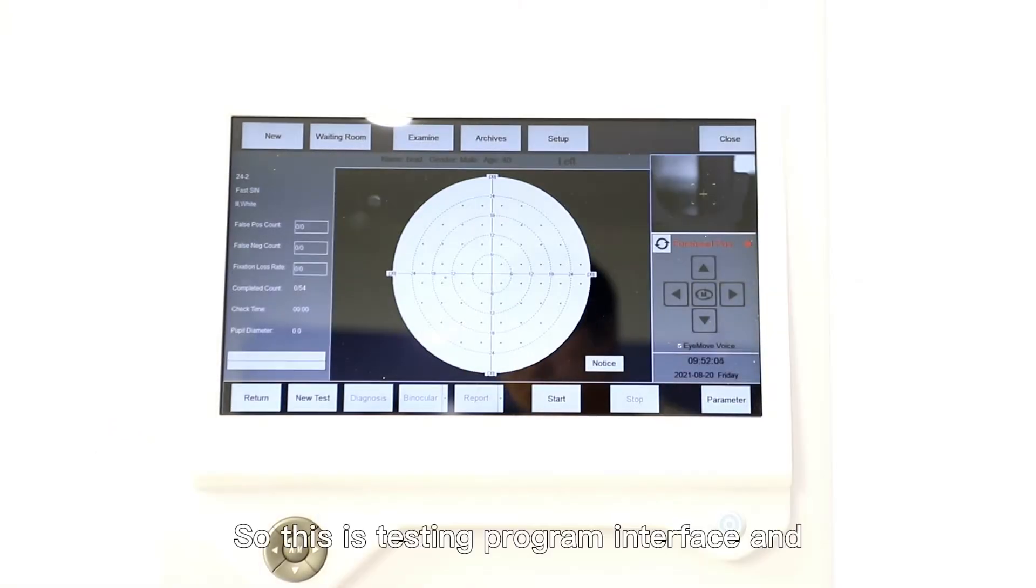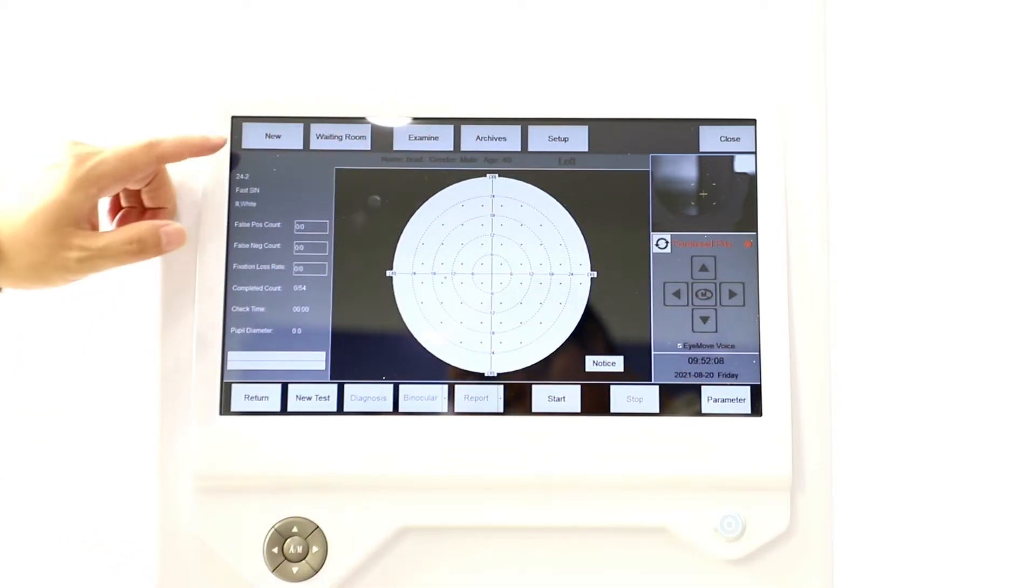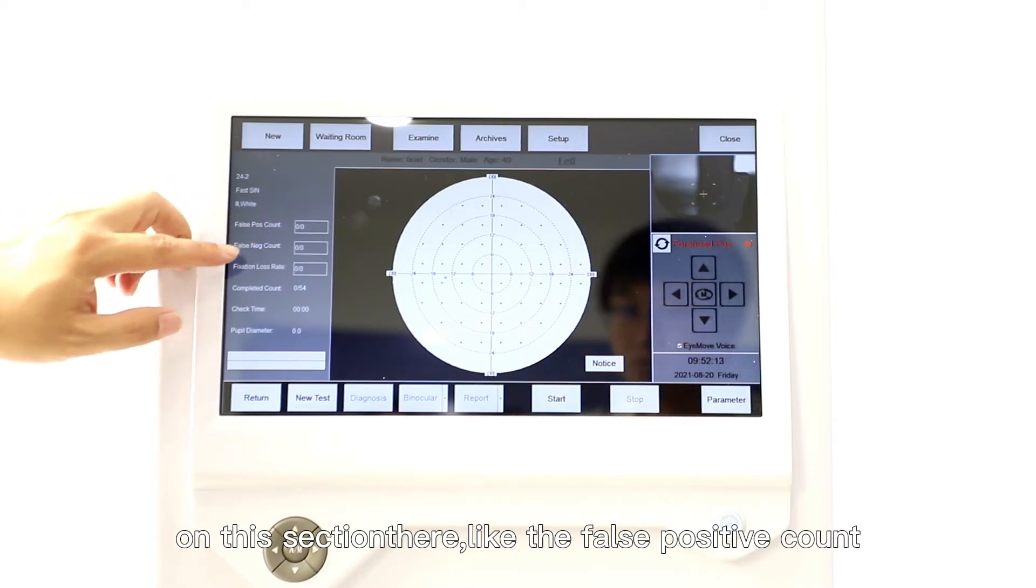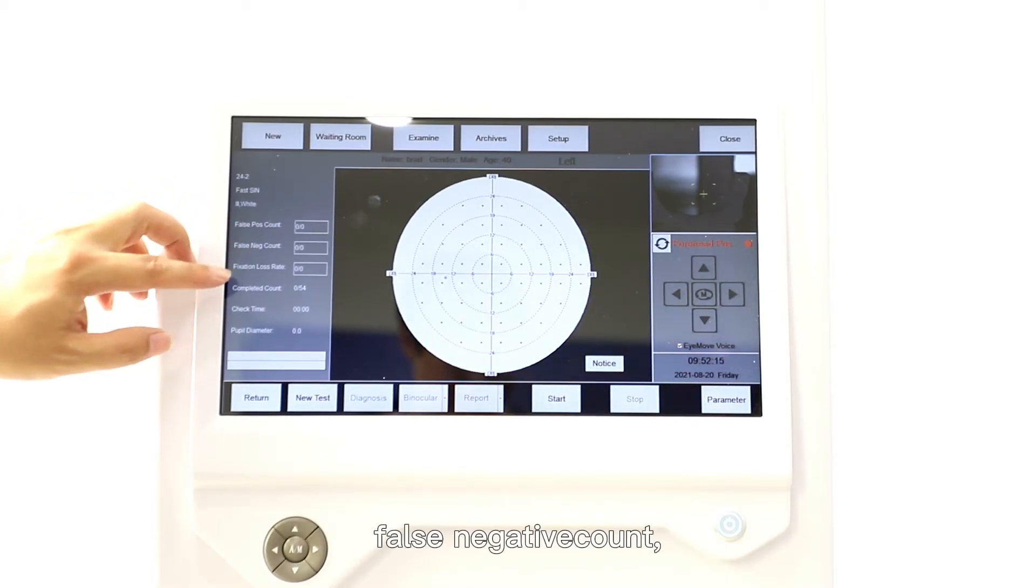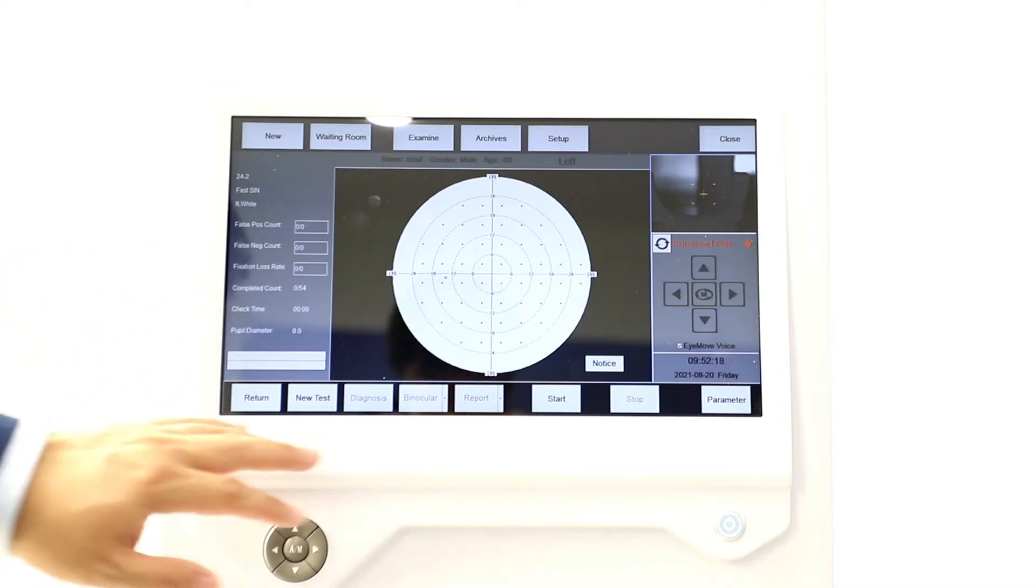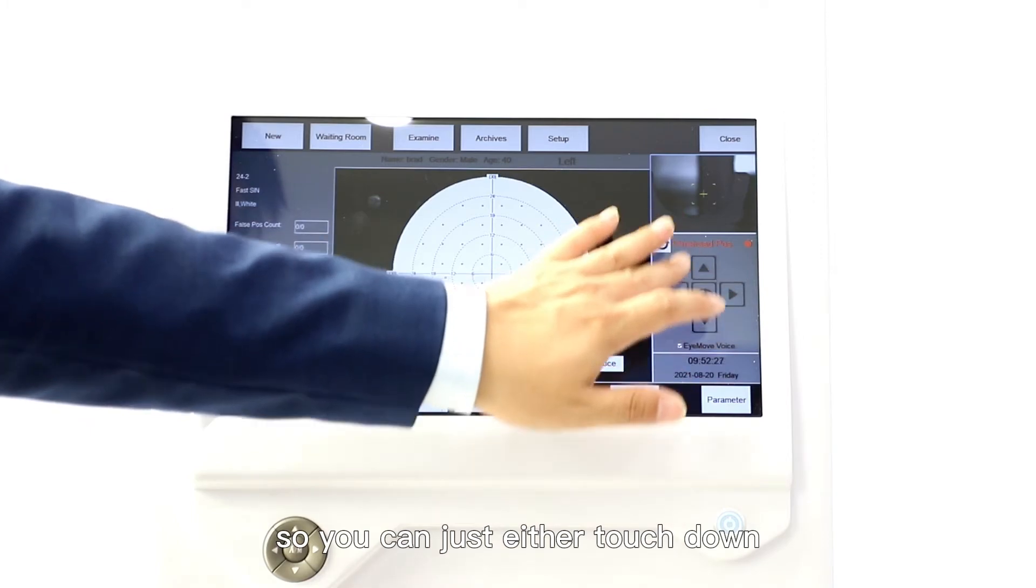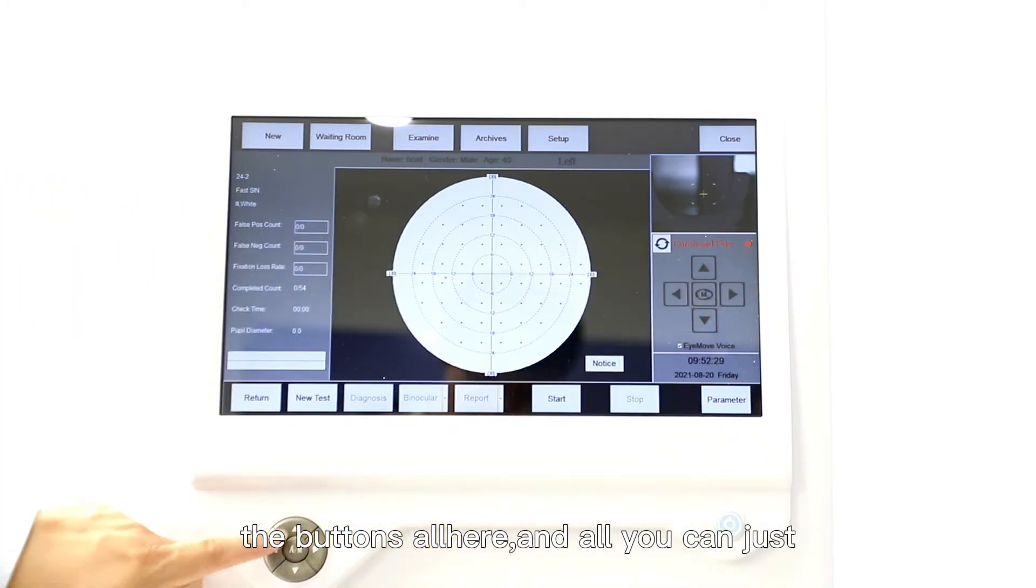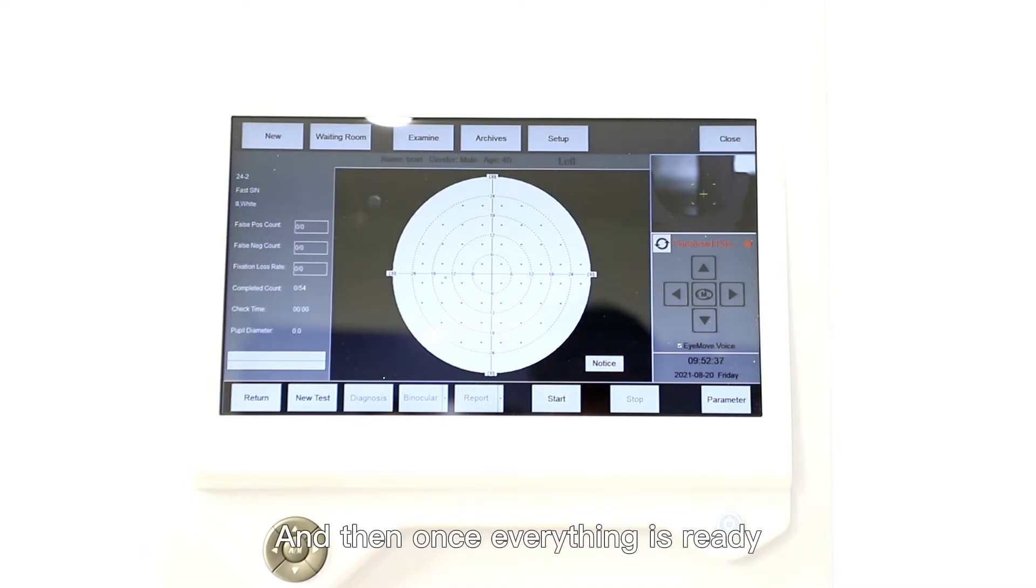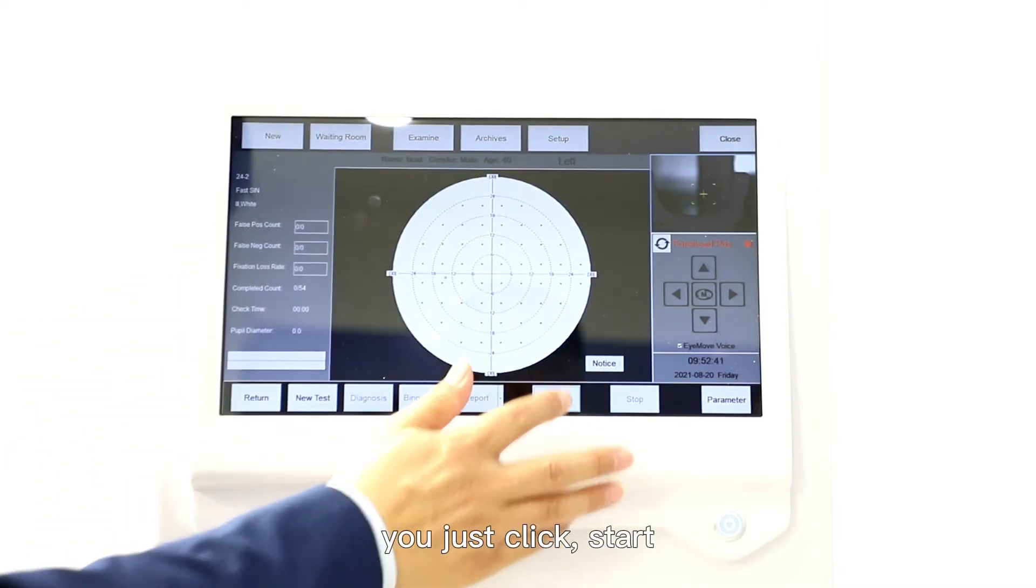This is a testing program interface. On this section there are the false positive count, false negative count, fixation loss rate, and this is for the adjustment of the chinrest and headrest as well. You can use the touch-down buttons over here or you can choose the buttons over here. Once everything is ready you just click Start.